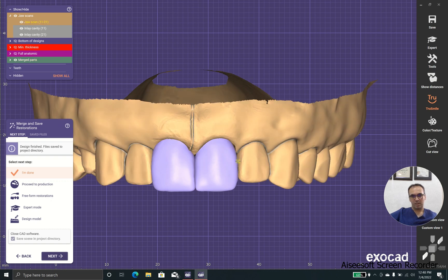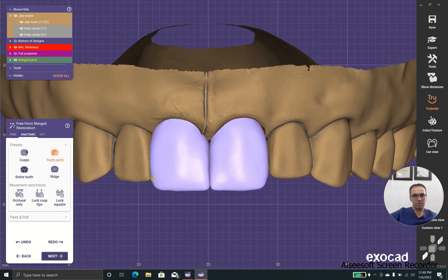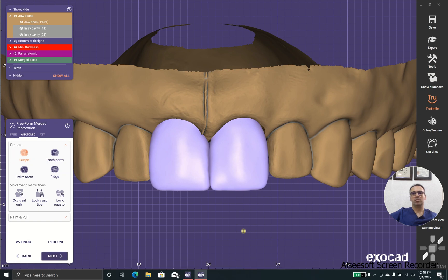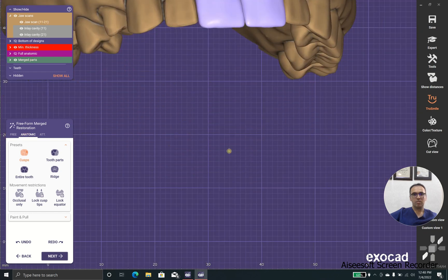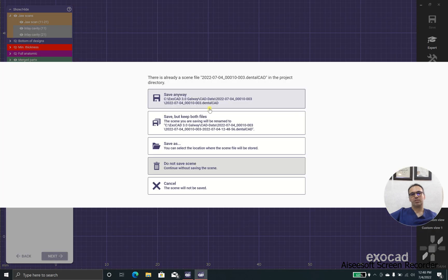Oh my gosh, sometimes it happens. As you can see, this line angle and this line angle don't look good. So I'm going to freeform it again and bring this out a little bit. Yeah, it's far better. And then this curve is smaller than this curve, so I adjust it. Yes, that's good. Perfect — this is a perfect laminate, and it should shine for the patient for a long time.